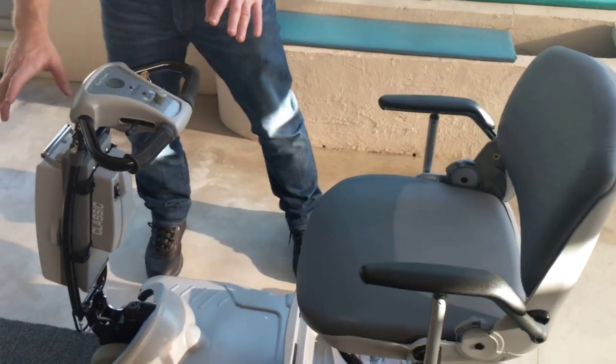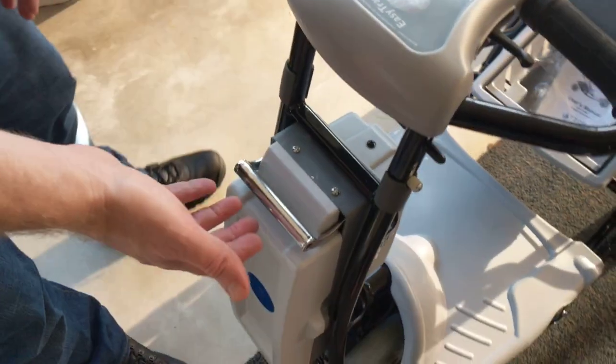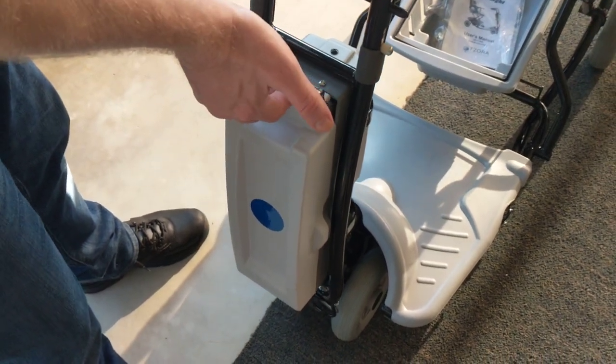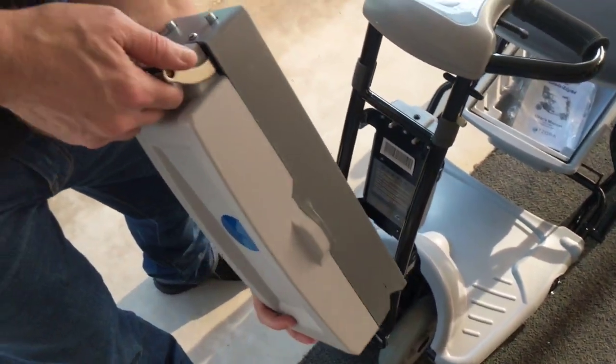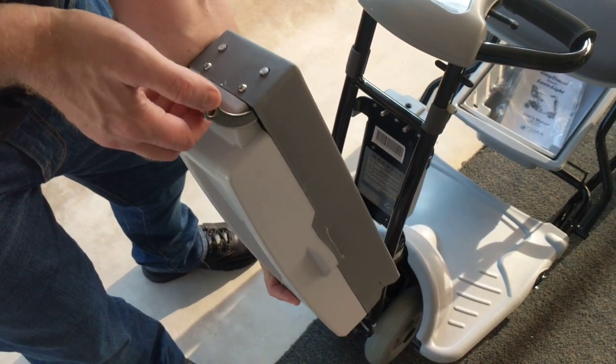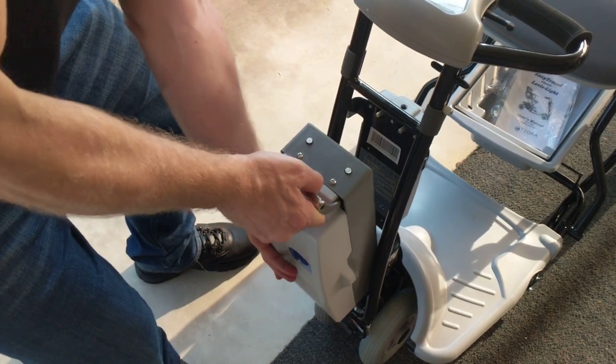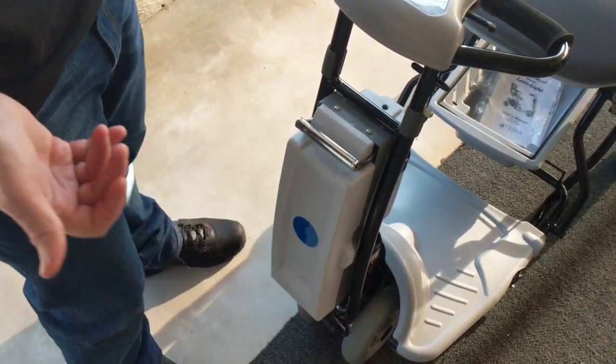The first feature I'd like to focus on is the front of the scooter. You have a removable battery that comes with the scooter — you lift and you remove. By lifting the handle of the battery, the safety mechanisms disengage and allow you to slide the battery out.